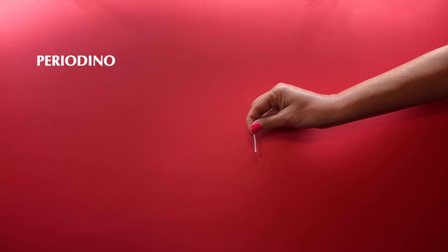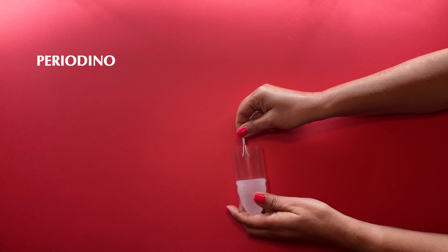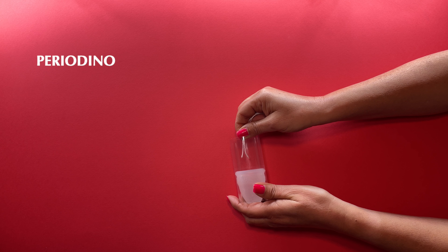The IUD is inserted into the uterus and the plastic threads will come out through the cervix. I will simulate the threads of the IUD with these thicker threads so that you can see them more easily. These threads will be cut by the gynecologist, who will leave them about 3 centimeters long.